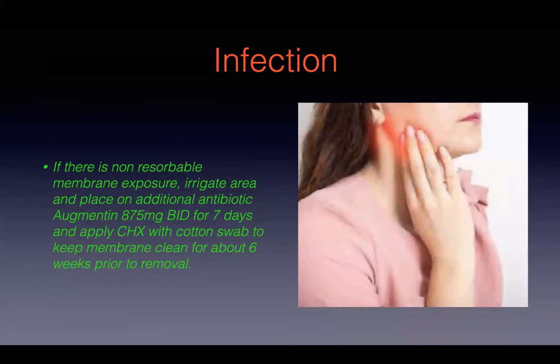For my second case, I wanted to stick with Winnie here. So after 5 years, she's back now. She's ready to restore her mandibular missing teeth with implants and crowns. So this was taken March of this year.